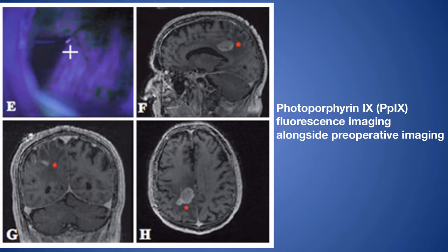And personally, my interest in imaging comes out of that, because all of the imaging that has really been the engine behind so much in clinical neuroscience, to integrate it into interventions like surgery, requires a co-registration step, requires importing that data into the operating room environment while you work. That's what image guidance was all about, and that's what our current interests in fluorescent technologies are about.